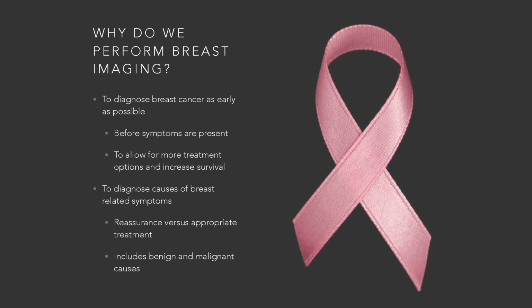We also do breast imaging in order to diagnose causes of breast-related symptoms. Sometimes this may be simple reassurance. There's normal breast tissue that is being felt. Maybe there's a benign cyst, or maybe we do find something malignant and we're going to help dictate the next step.